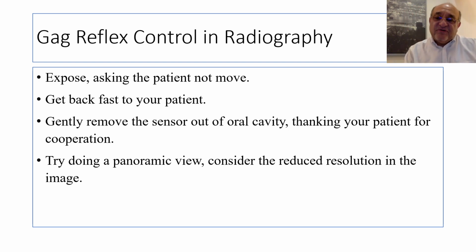Doing a panoramic radiograph, we all know that a panoramic radiograph does not give the same resolution as that of the periapical radiograph. So please consider this, plus the added exposure to the patient. So please let us stick to the periapical radiographs, which are better in terms of resolution. They are better in terms of patient exposure.